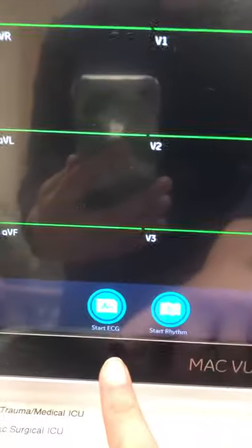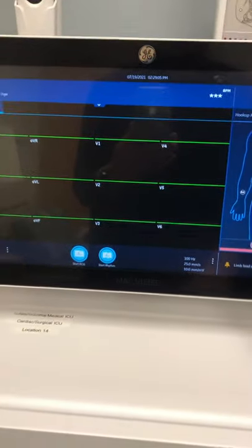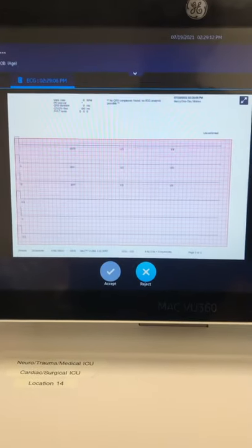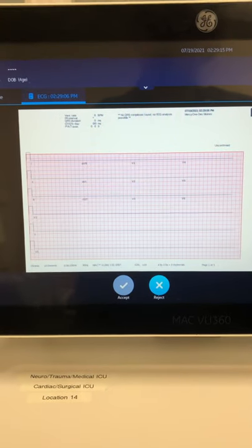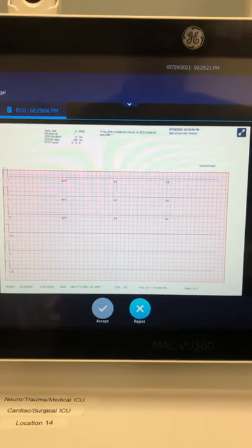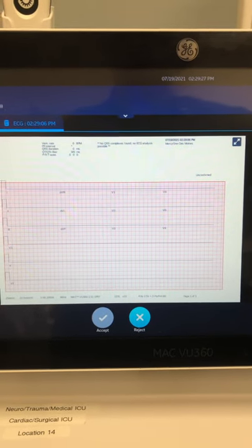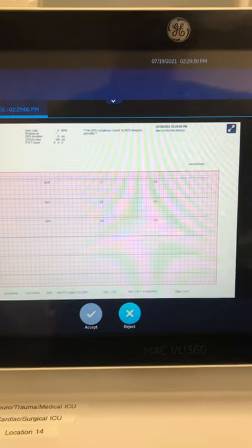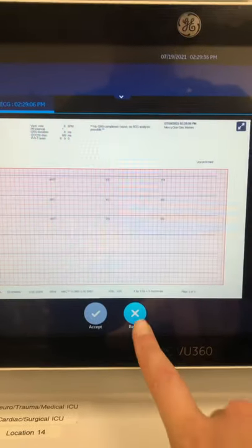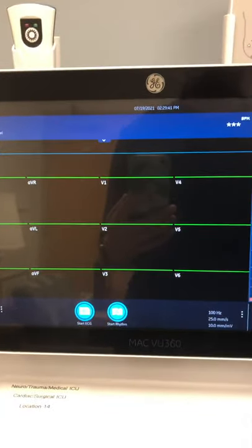Once you have your green check mark, you can either hit Start EKG or press EKG on the soft pad. Hitting EKG pulls up a preview of your EKG. Unlike the older model, which would print immediately and fulfill your Cerner order, with this machine you can hit Start EKG as many times as you want. If you don't print it, it doesn't fulfill the Cerner order. For example, if I'm trying to catch a heart block and I don't see it in the preview, I can hit Reject and it comes back to the screen — my Cerner order still isn't complete.